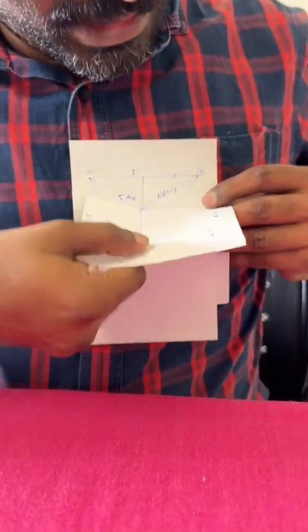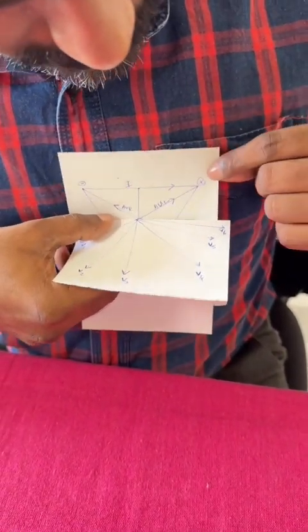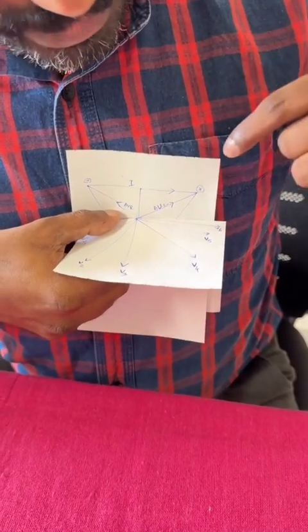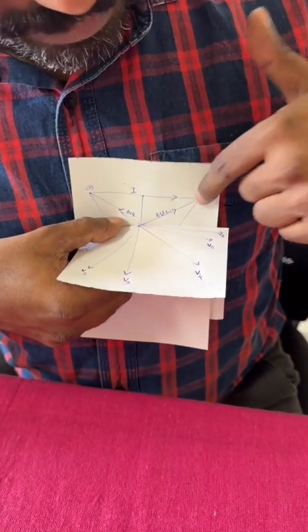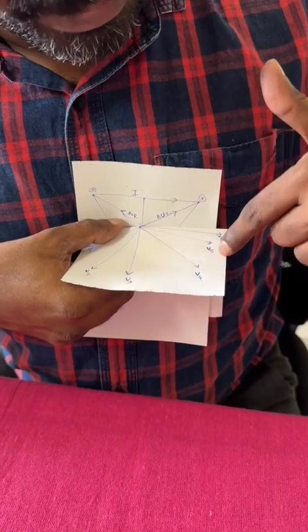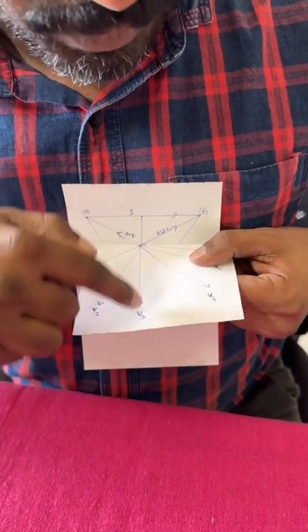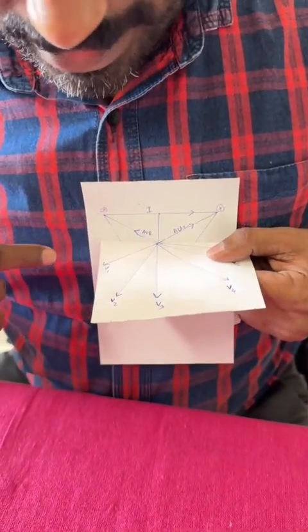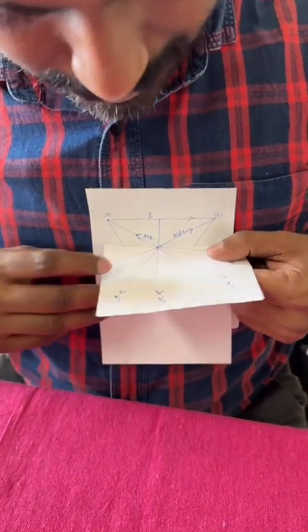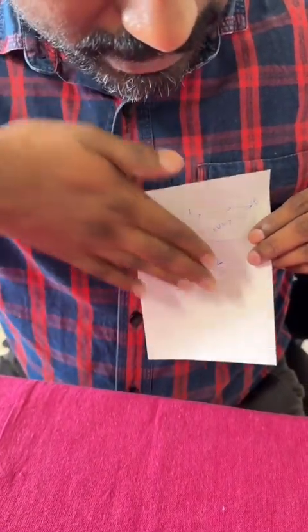Okay, so when you look into the high lateral wall, which all leads are pointing to the high lateral area? Lead 1 and AVL are pointing to it. So the high lateral wall is represented by 1 and AVL, and the lateral wall by V6 and V5, and the anterior wall is formed by V2, V3 and V4, and the septum by V1 and V2.